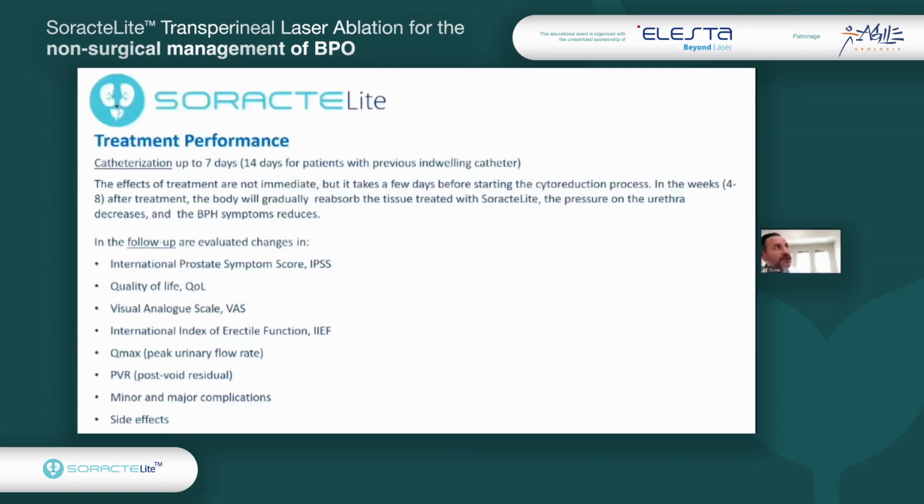It depends on patient characteristic on the prostatic gland. So I cannot give you just an exact number of days to keep the catheter in place, because for example, patients who come to us with an indwelling catheter may need at least 14 days before they are able to remove the catheter. So the effect of the treatment also we have to take into account that it is not immediate, but it takes a few days before starting the size reduction process.